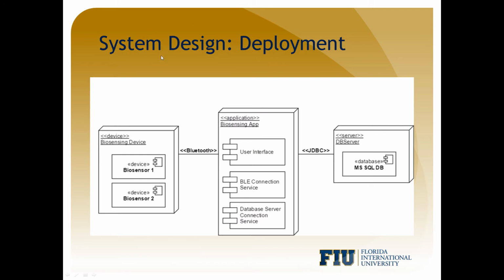Our system design is as follows. We have a biosensing device with different types of sensors that connects to our app through Bluetooth Low Energy. Then our app sends the data to a server where it's processed and then returned to our app to be shown as a graph.